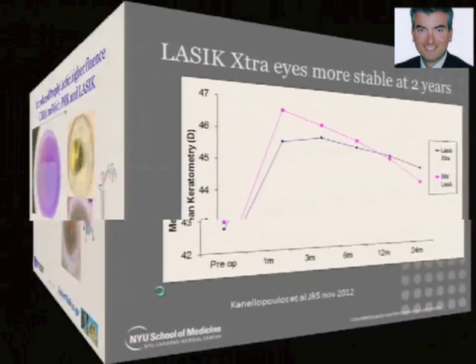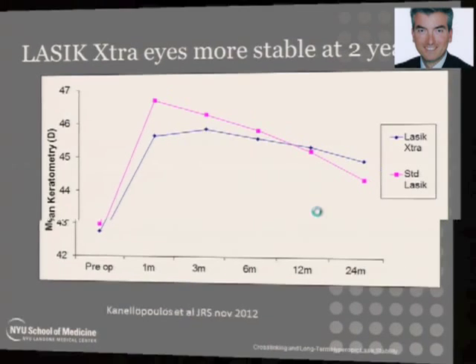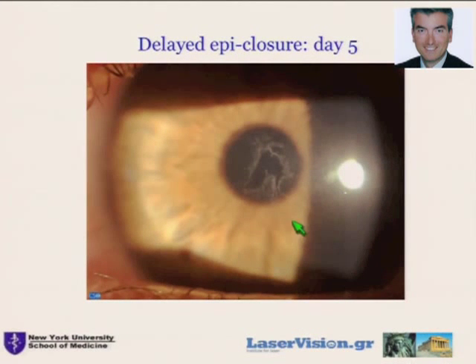And our group in Athens has just published this month that probably LASIK Xtra would be a requirement in all hyperopic LASIK cases, because bizarrely here, the procedure does not flatten the hyperopic steepening that we perform, but stabilizes that loss of steepness that hyperopic LASIK cases have through the years. This is a contralateral eye study we're publishing this month in the supplement of the Journal of Refractive Surgery, and the dark blue line are the LASIK Xtra hyperopic eyes, a stunning difference to the fellow eyes that were not cross-linked. Of course, this comes with some cost.